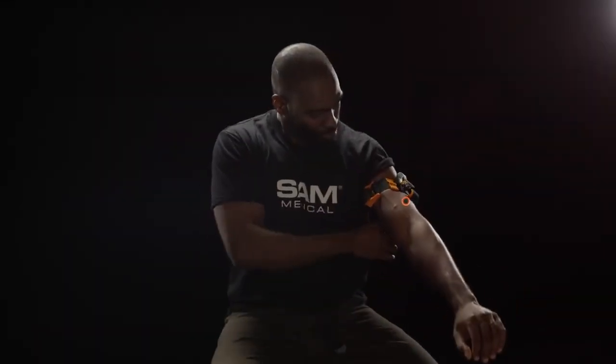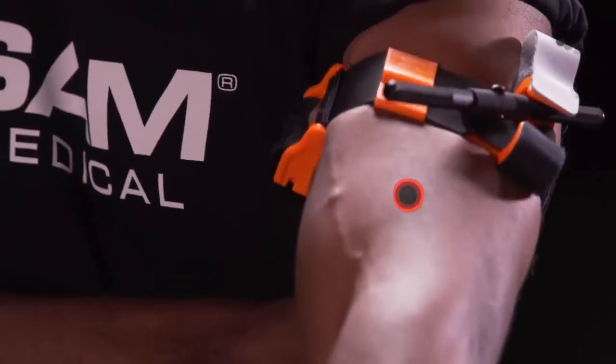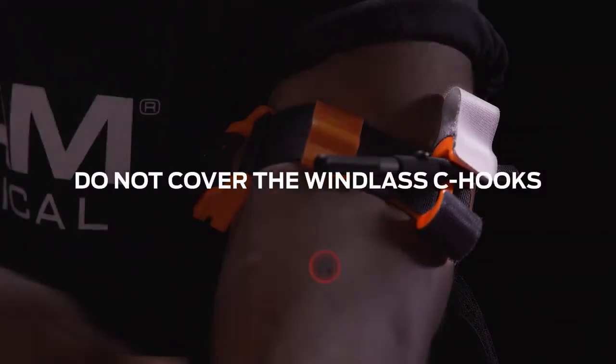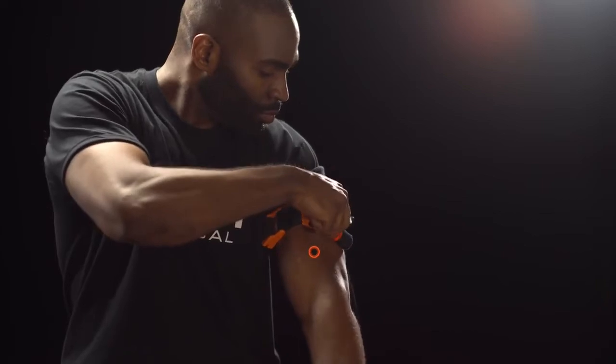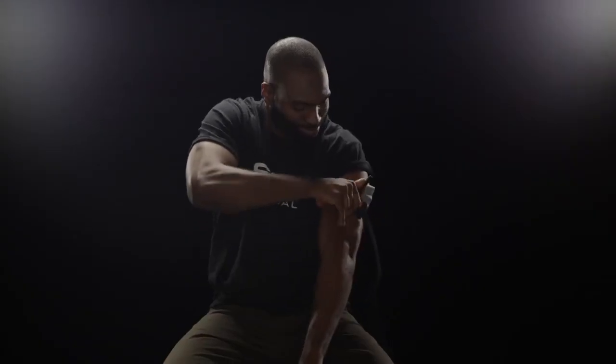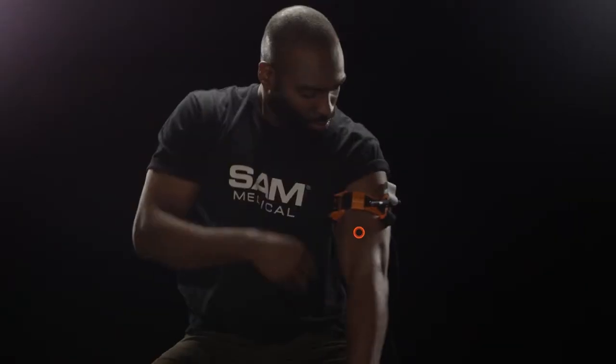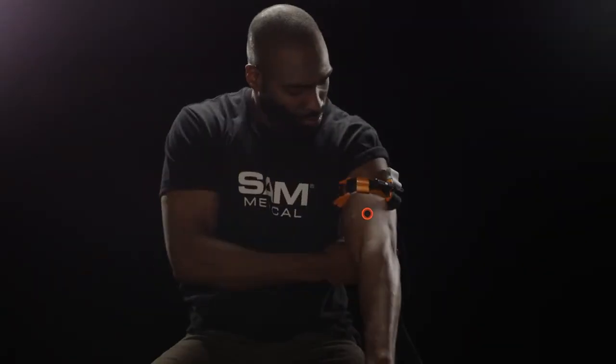Maintaining tension, press the strap back upon itself to attach it in place. Do not cover windlass C-hooks. Twist the metal windlass rod until the bleeding stops. Secure the rod inside the windlass C-hook and confirm that bleeding has stopped. If bleeding persists, tighten Sam XT with additional twists of the windlass.